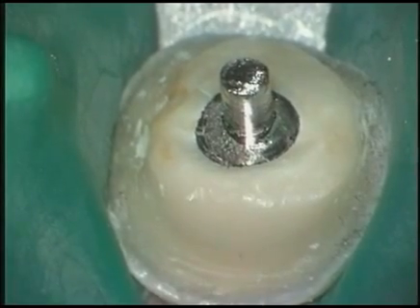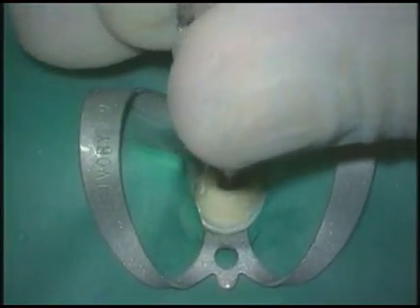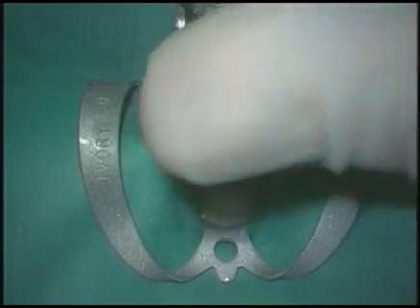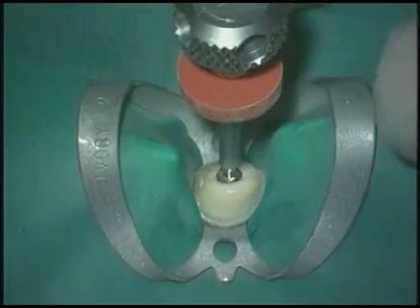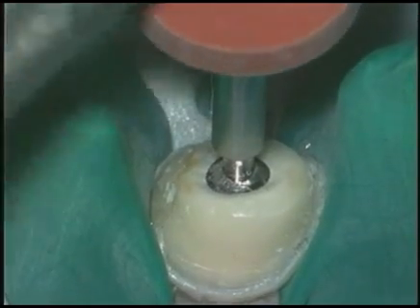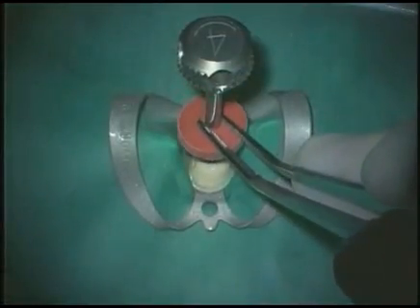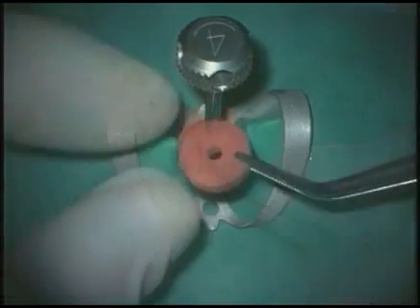Okay, with this exposed, we can now select the tubular tap. It's very easy for this to bite and engage soft gold, and it doesn't take too much rotation on the handle to secure and draw down the tap. We'll go ahead and continue rotating the tap handle until it's secure.